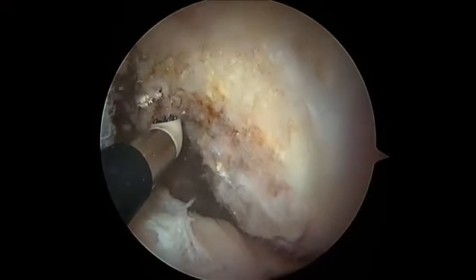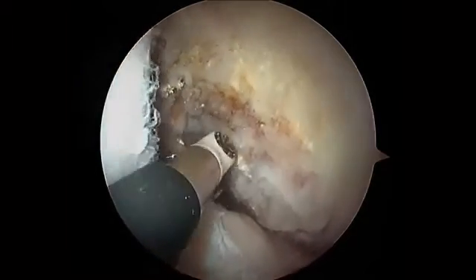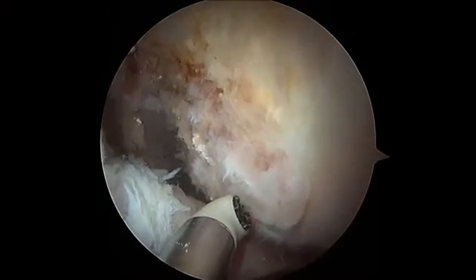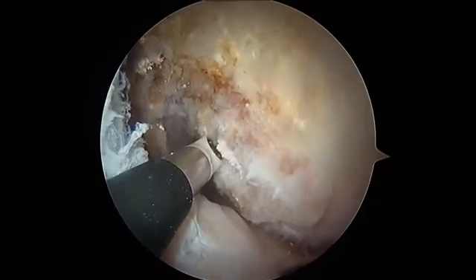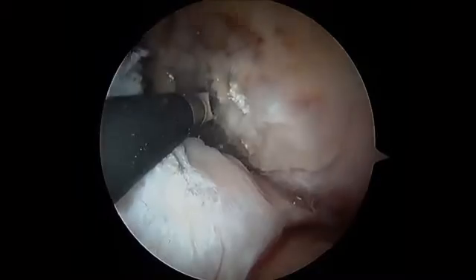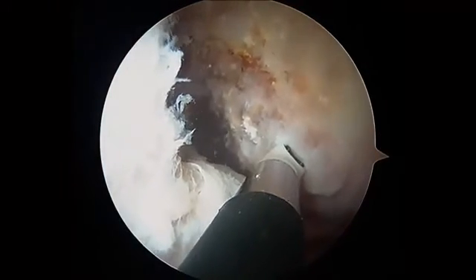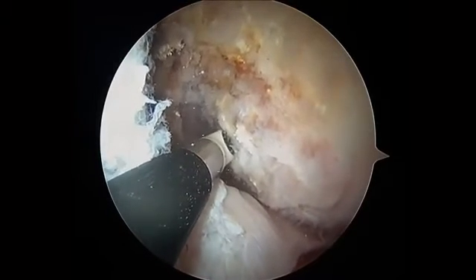The other way of thinking about the E is equidistant. It's equidistant between the top of the notch here and the posterior femoral cartilage of the lateral wall. So equidistance between the top and the bottom here gets you somewhere in this ideal position. A is anatomic. Again, look at how big the footprint is. All this tissue is insertion site tissue, is footprint tissue. You can't cover the entire footprint with your tunnel and your graft, so you have to be strategic. We want to put our graft right here.